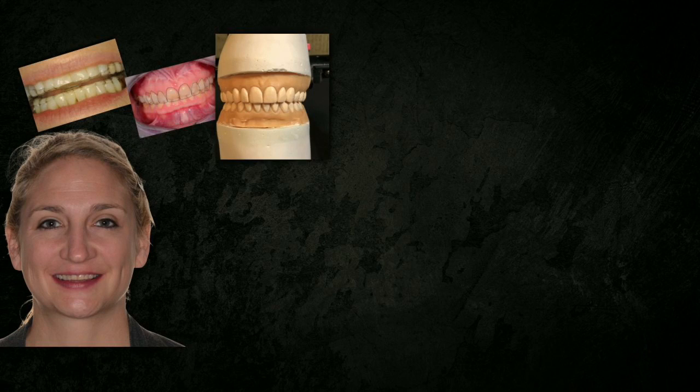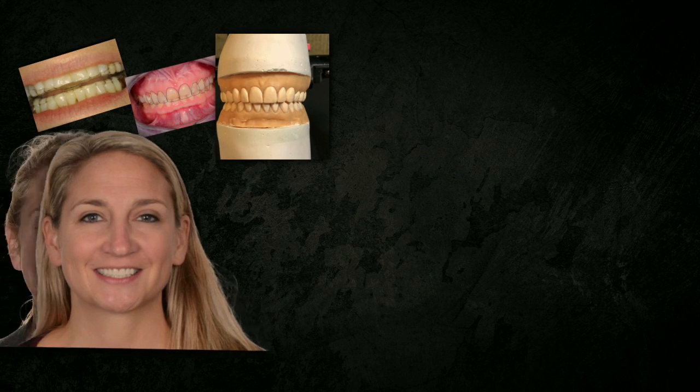So Melanie started with some sore muscles and kind of a bad bite. We deprogrammed her for a few days. Melanie miała problemy, miała dolegliwości bólowe, mięśniowe, dostała deprogramator na pierwsze dni. We did our records and did our 2D and 3D treatment planning. Zebraliśmy dane, zarejestrowaliśmy sytuację naszej pacjentki, zrobiliśmy analizę czy też planowanie w 2D, a potem w 3D.